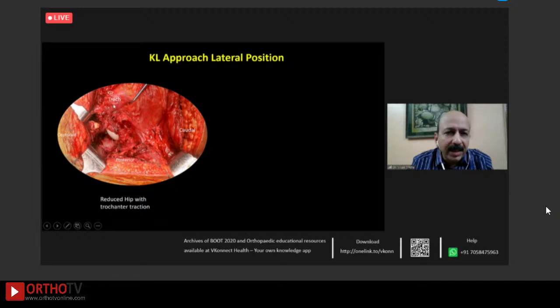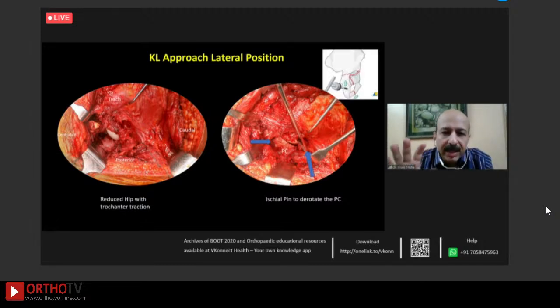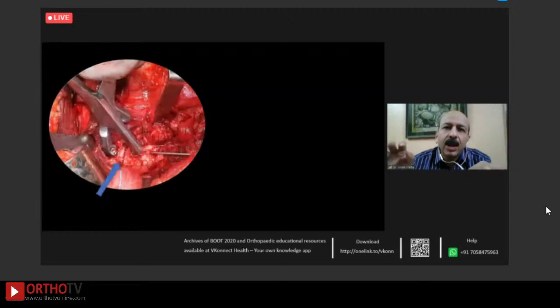If we see, this is the greater trochanter. I removed the fragments which we needed to, the small intra-articular fragments, the posterior and the cephalad ones, reduced it, and then went about fixing my posterior column after the reduction. You can see that the fracture is there with the ischial spine and ischial tuberosity. The reduction of the posterior column, how is it done? The same way, I tried to derotate that fragment, but was not able to get that displacement properly reduced and compressed.